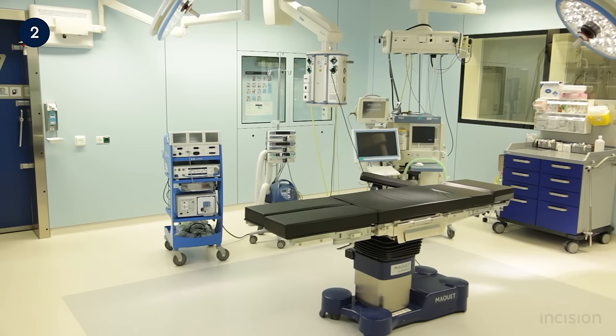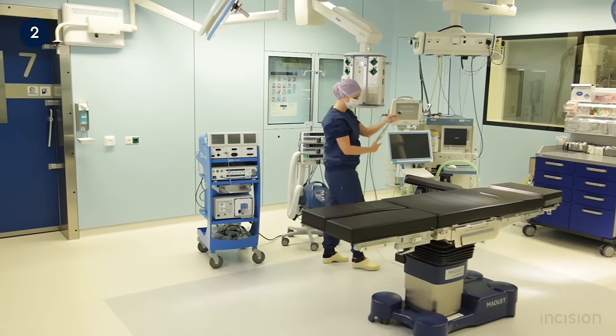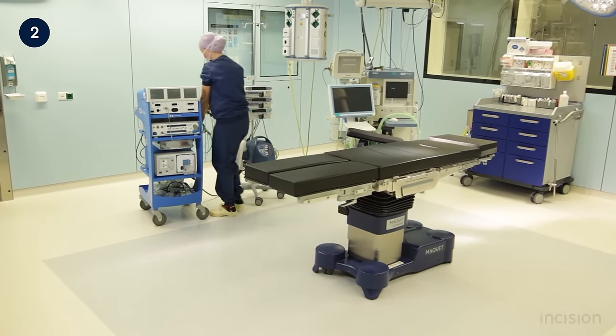Movement of some of the parts of the table is reliant on electro-hydraulic motors. For this reason, the table should be connected to the main socket to charge when not in use. When the table is in use, the power cable should be unplugged and stored safely.